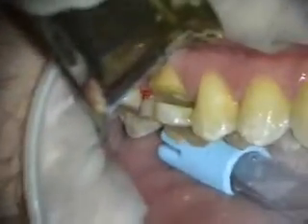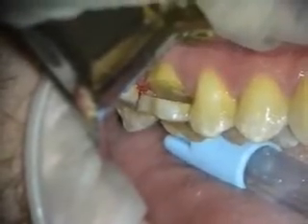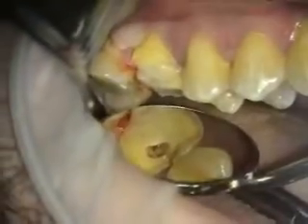What we're doing first is we want to decoronate the tooth. You can see I'm about halfway through. And now we're going to start sectioning the tooth.